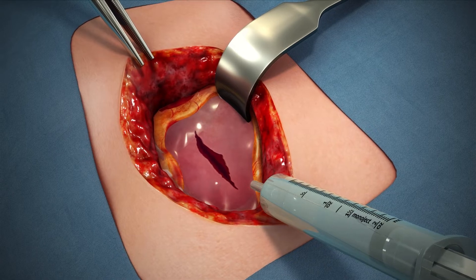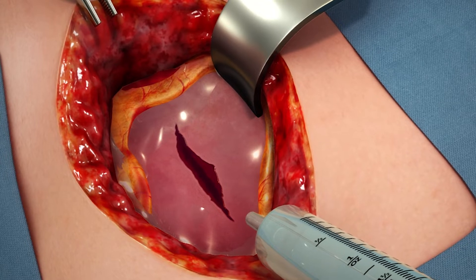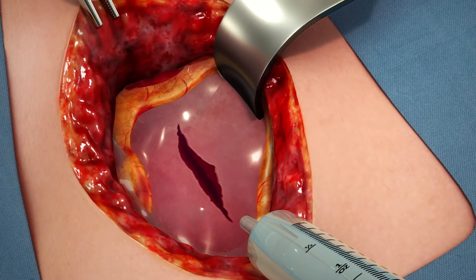Arch Therapeutics is addressing complex yet common challenges in wound care with its proprietary self-assembling peptide technology.